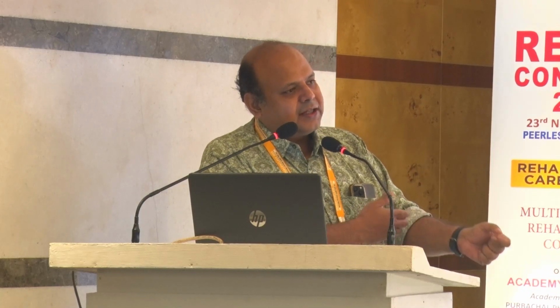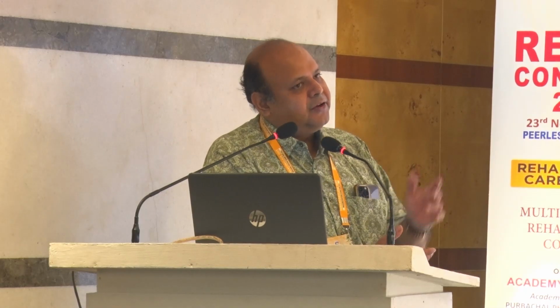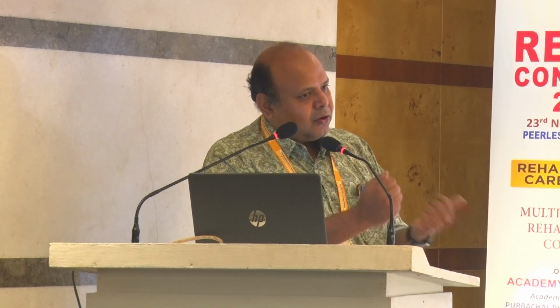But if something is contracting while the rest is retracted back, then you know there is a partial thickness tear. If it is a full thickness tear, the problem is solved; you know offhand. The only issue is the partial thickness tear of a deeper or superficial fiber, which gives you the inhomogeneous contour deformity on strain. That is also important.